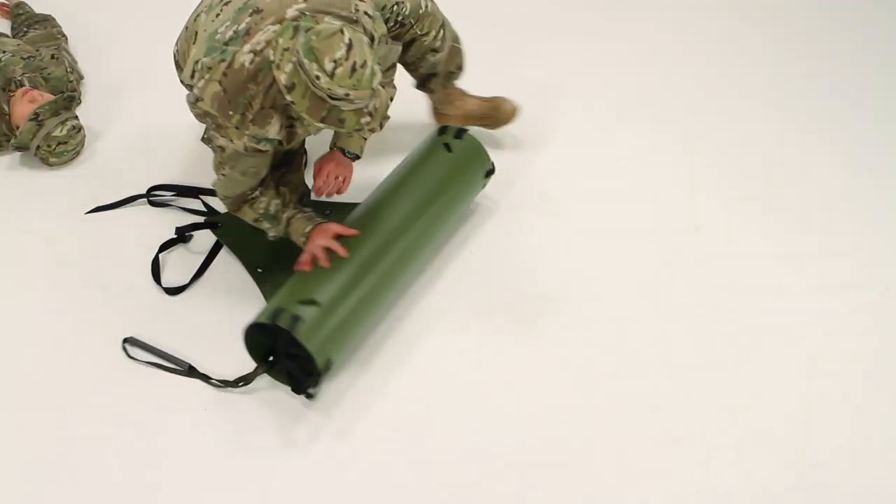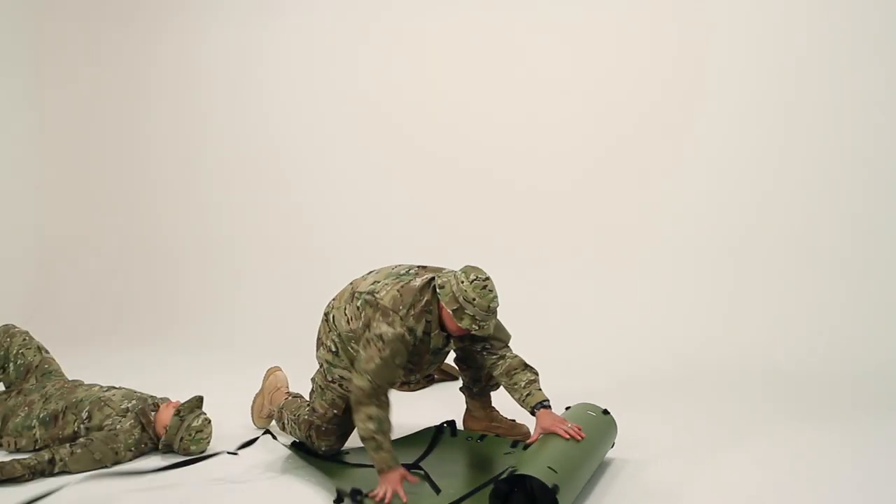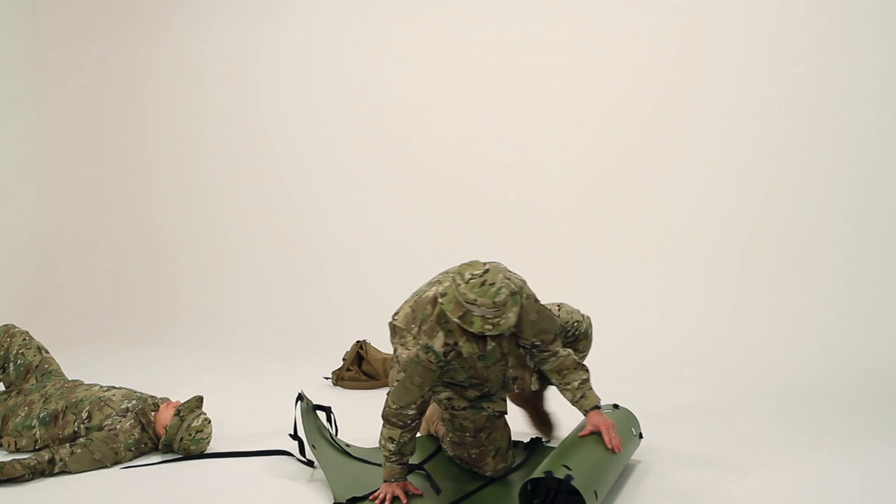While kneeling on the free end, unroll the Sked by pushing it away from you. In the field, this allows you to maintain a low profile to avoid enemy fire.